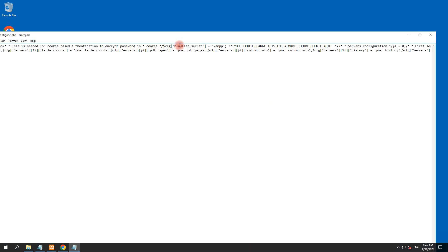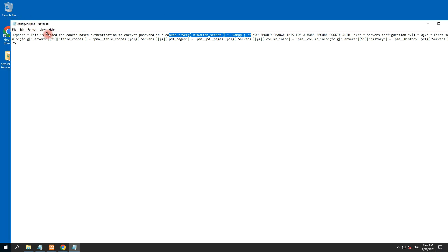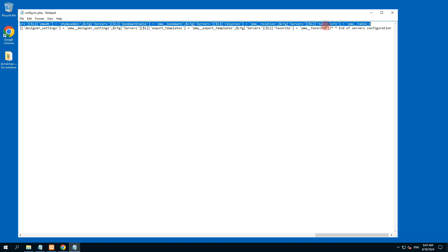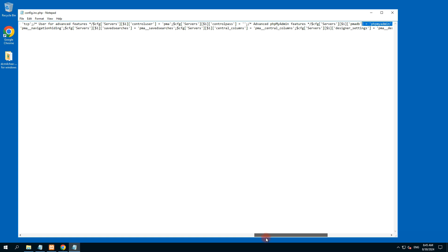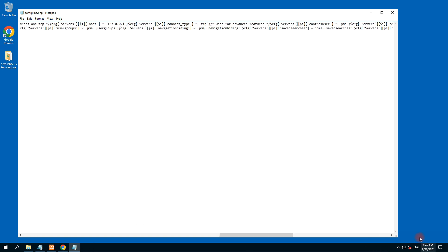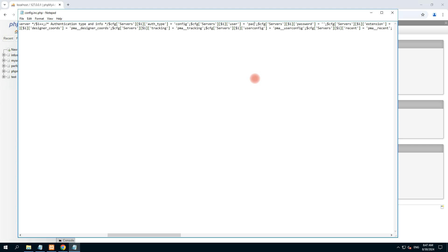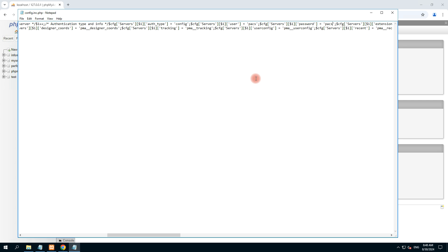We search for 'authentication type'. Here we find authentication type — the type should be set to the user. The user is currently 'root', but we have created the user with the name 'pacs' and our password was also 'pacs'. So in the user column we type 'pacs', and in the password column we also type 'pacs'. We save this file with Ctrl+S and close it.